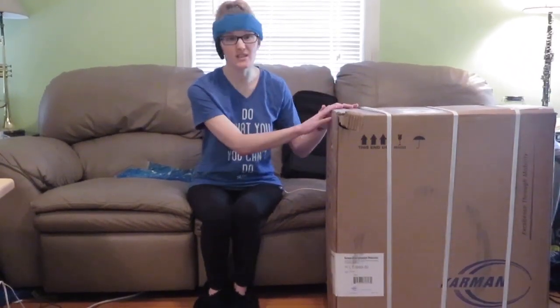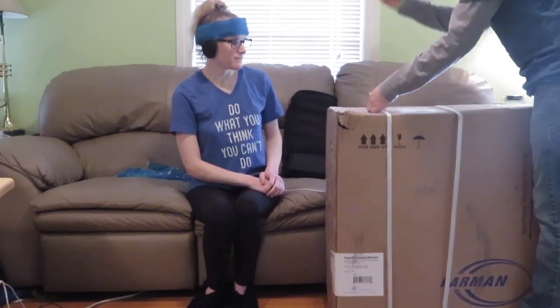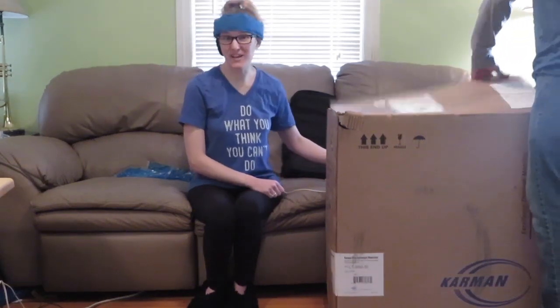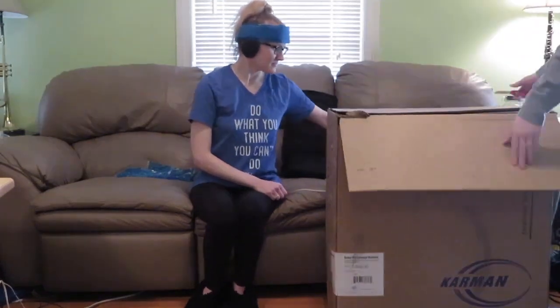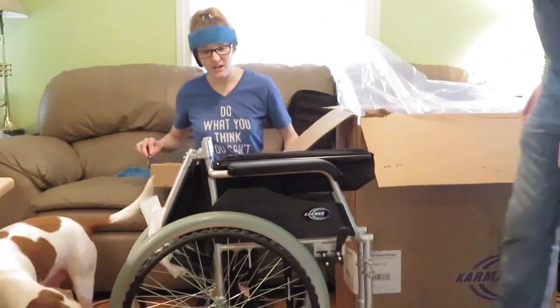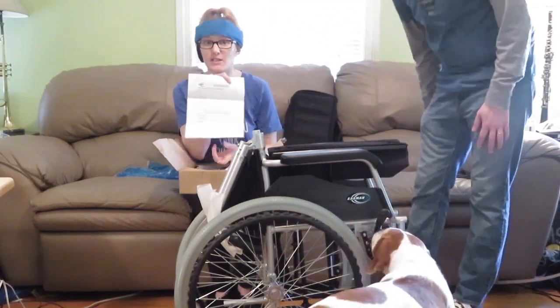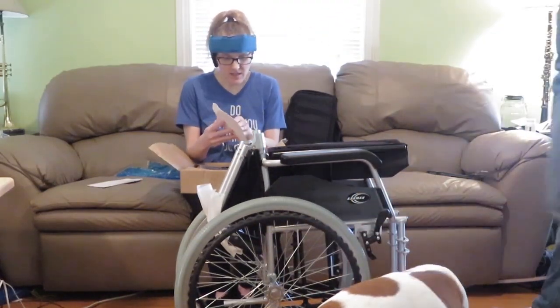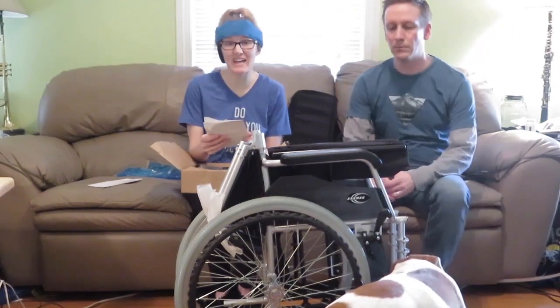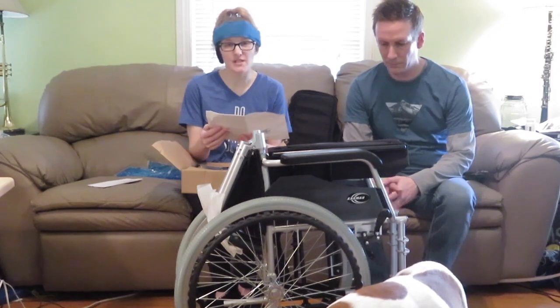So we are starting the unboxing. We're zoomed out right now because we want you to see the whole chair, and then we'll show you some up-close shots in a minute. I'm going to let Roger handle the knife. Got to make sure I fill out the warranty. This is the Karman LT-980 wheelchair, and I'm not going to go over all the specifications right now.